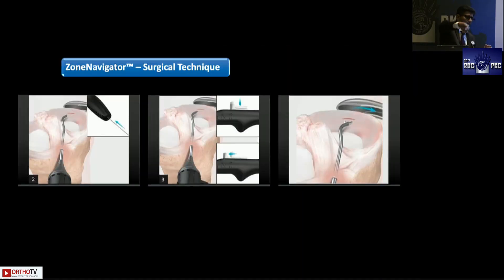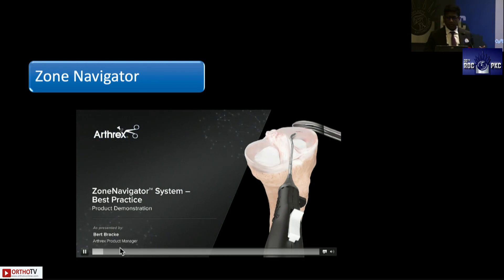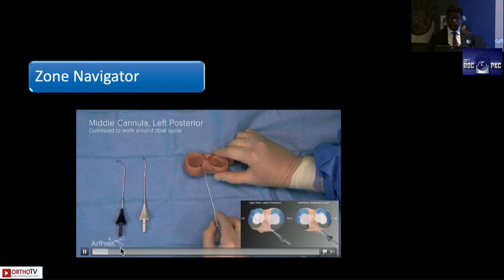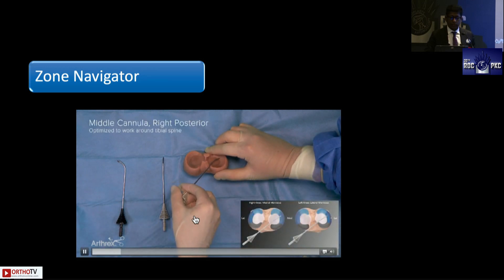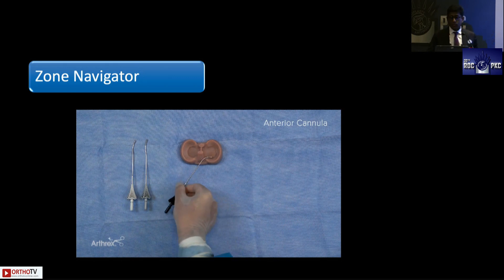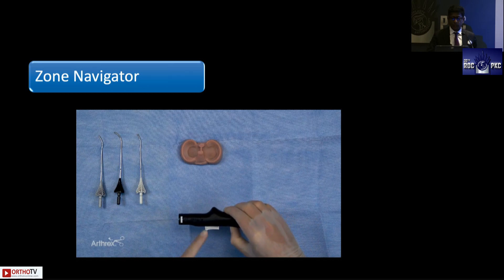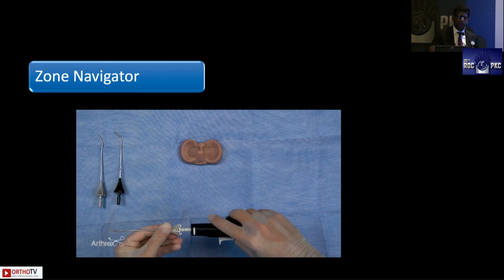The posterior cannula can reach up to the posterior horn — so if a patient cannot afford all-inside repair, with slightly more pie crusting and more valgus force you can reach almost to the posterior horn, avoiding neurovascular injuries. The anterior cannula is very useful for anterior horn tears. This animation video shows how to use these cannulas — one with standard curvature for the posterior and middle horn, and one with more curvature reaching far anteriorly. You simply put the needle and push — it's a very simple technique.